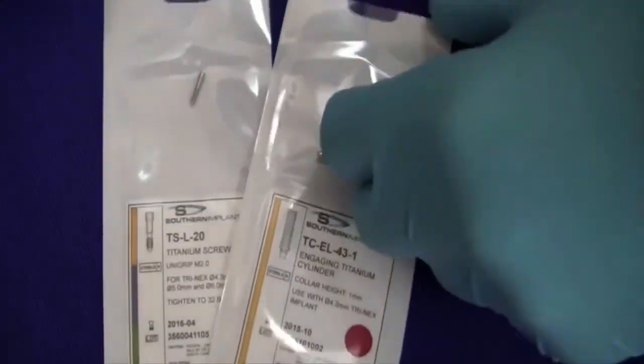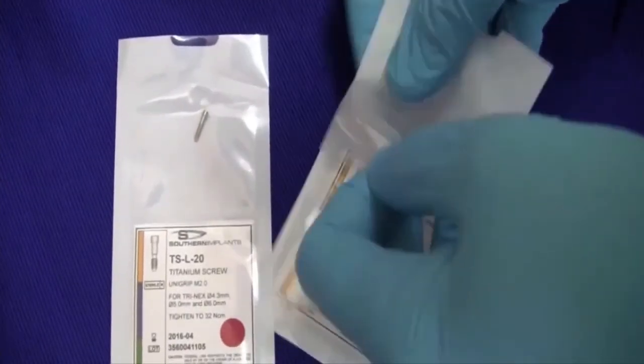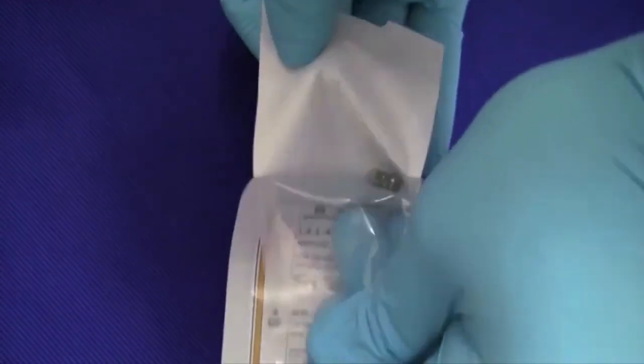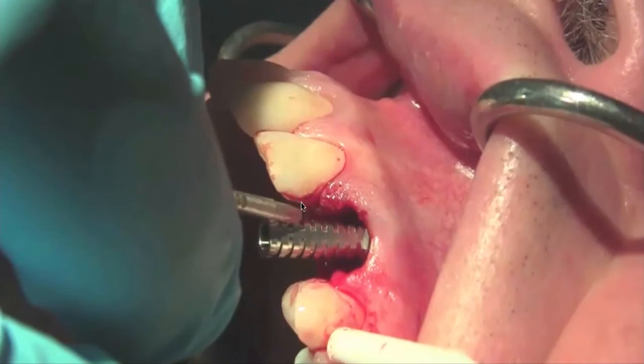So the next step is to utilize some components. We're utilizing the cylinder for temporary crowns and a screw. It's important that you also have in your armamentarium an analog of this system, because the analog is going to facilitate the handling of the implant. And you need to calculate the interocclusal distance.